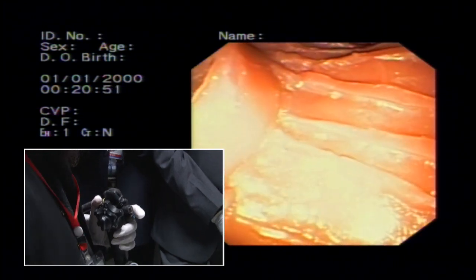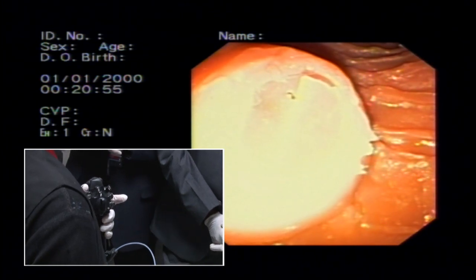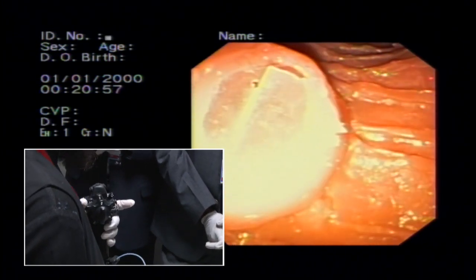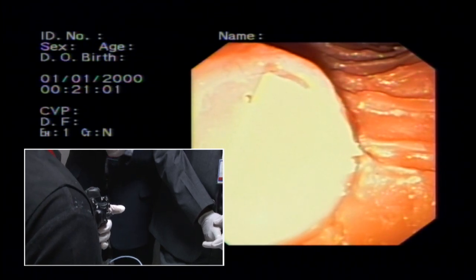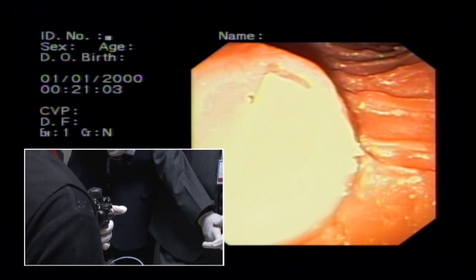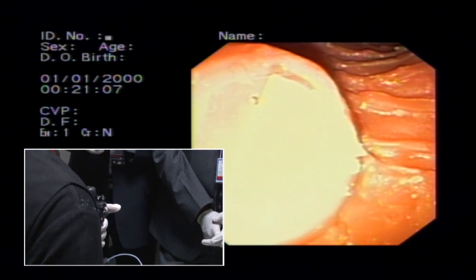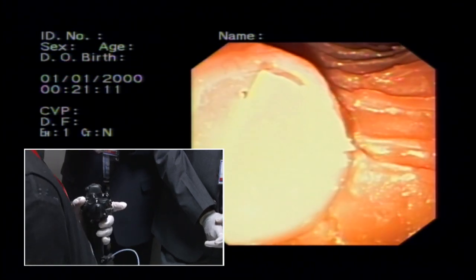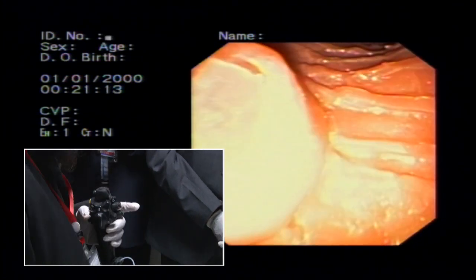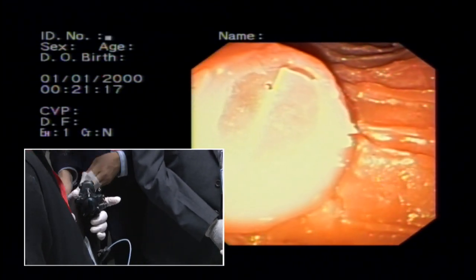जब आपका कैनुला दे रहा होता है, you won't believe it, even now when they're sometimes finding something that I want, I'm playing with it, थोड़ी सी और बेहतर position में है before it comes in. And I'm seeing just bringing it a little bit here. Up, this also sometimes left right is very important. Right left wheel is very important. So what we want you to do is to understand this. It's not about cannulating.